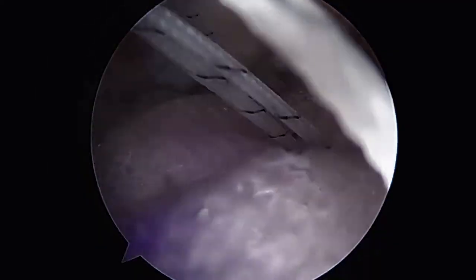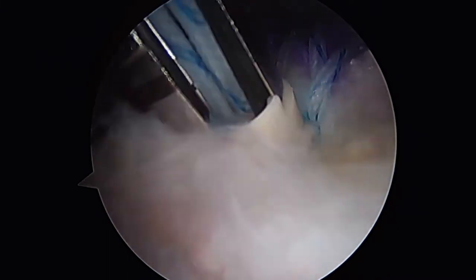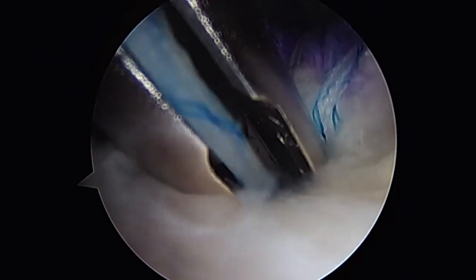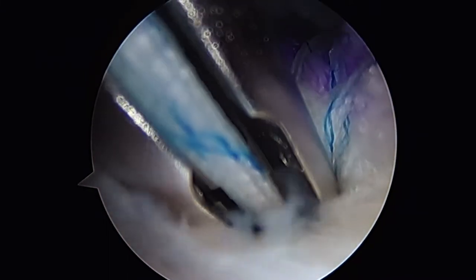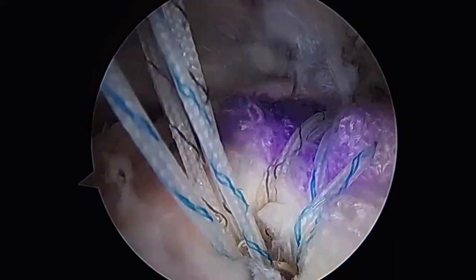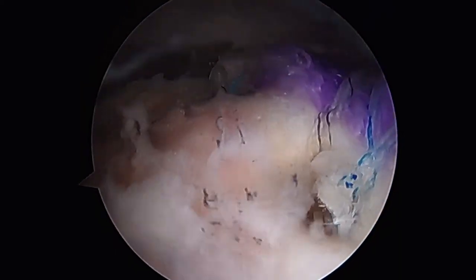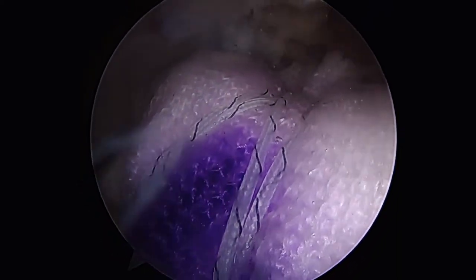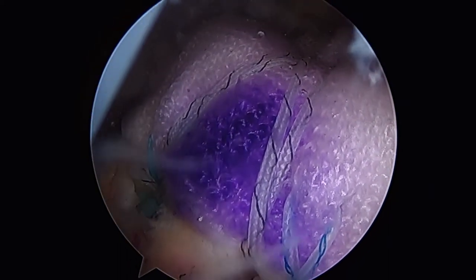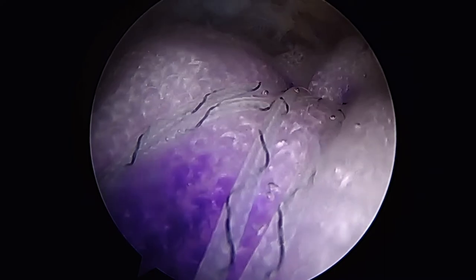We'll then simply repeat the process with the second anchor. We'll load one set of the graft's lateral sutures as well as two of its medial sutures into a knotless anchor, where we can then tension all four sutures back down to bone. The final repair has a transosseous equivalent rotator cuff repair with two additional medial row mattress sutures under the BioBrace, plus incorporation of the BioBrace structurally into the repair.